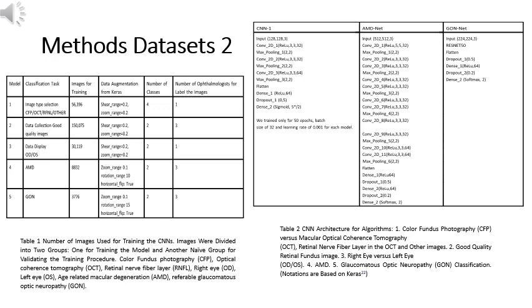The first model is very useful for cleaning unlabeled data sets, since it can separate the CFP images from OCT or other types of images like red-free image, autofluorescence, angiographic images, or other. The second model allows us to select only the CFP with a minimum threshold of image quality. The third model helps us to classify right eye CFP versus left eye CFP, which we use in our platform to display the best pair of retinas per patient.